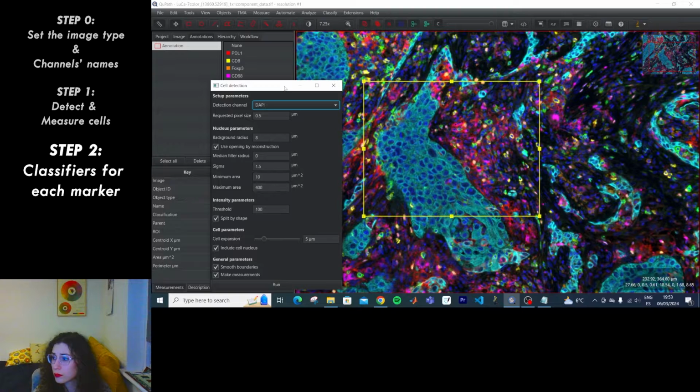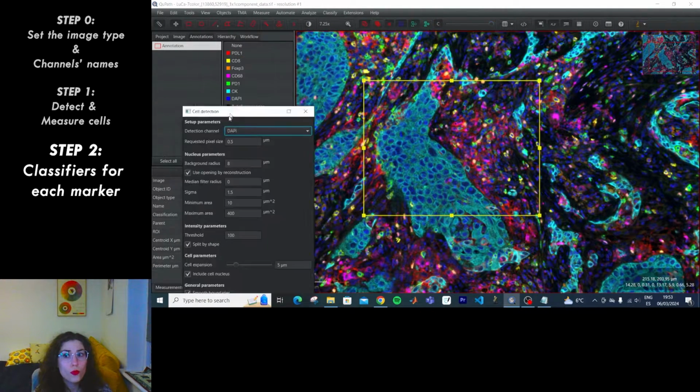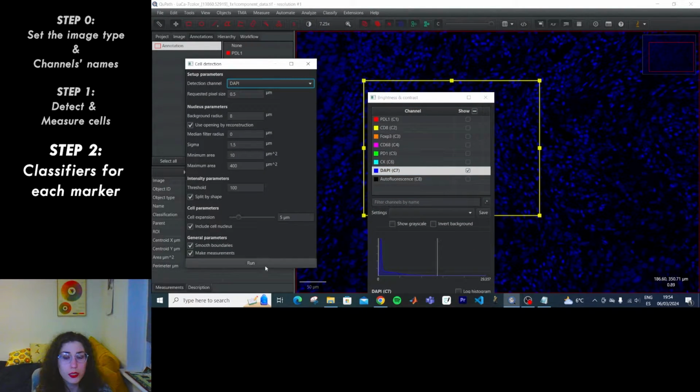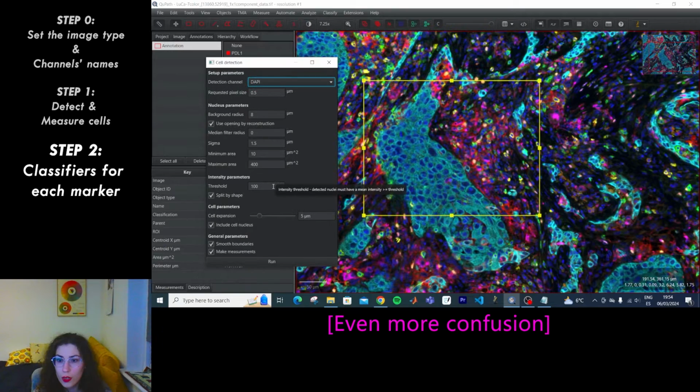Did it run? It didn't. Am I supposed to just show in one channel or something? Nope. Then why did it work? Maybe this? Let's see.